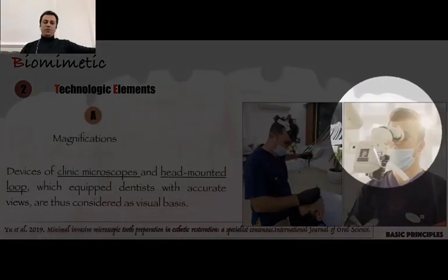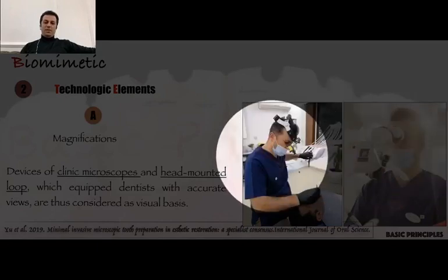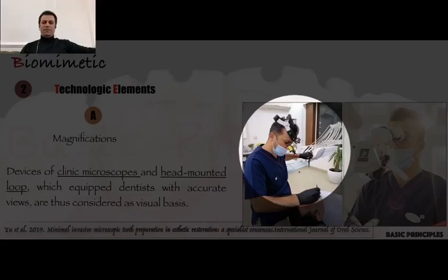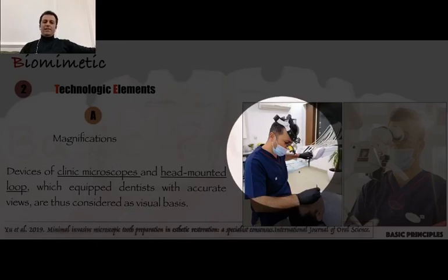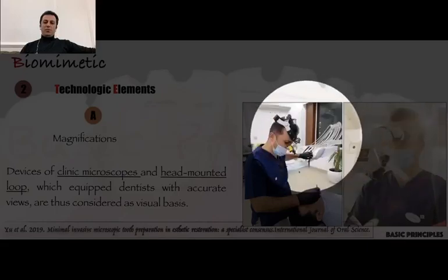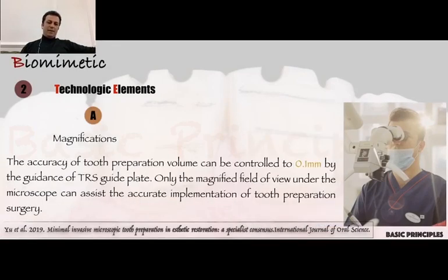Mostly I am using the microscope since the beginning of 2017, February 2017. And my loupe, I have used since late 2010, around 2011, but I changed many loupes. Now I have this one. It helps me in the areas I cannot reach with the microscope. 90% of the work I do by microscope, and the rest by the loupe. I don't work with the naked eye because I do not trust my eyes' visual acuity.